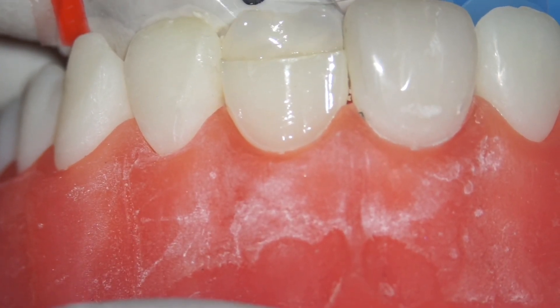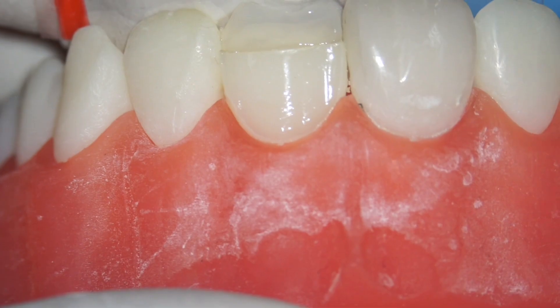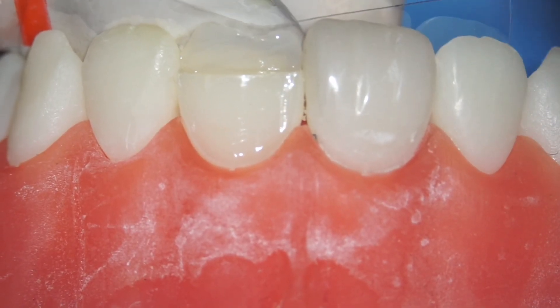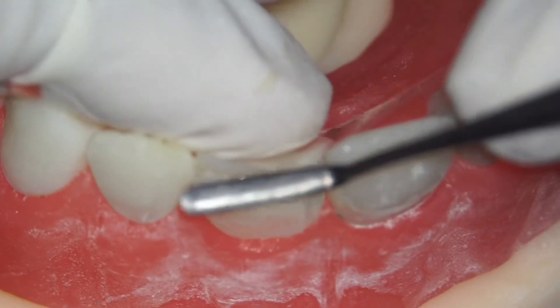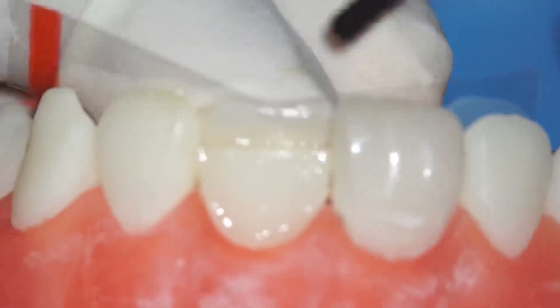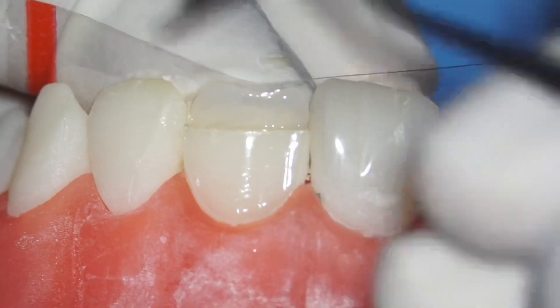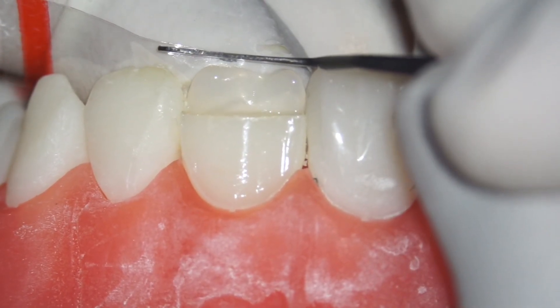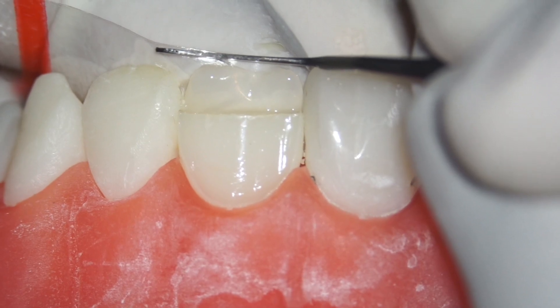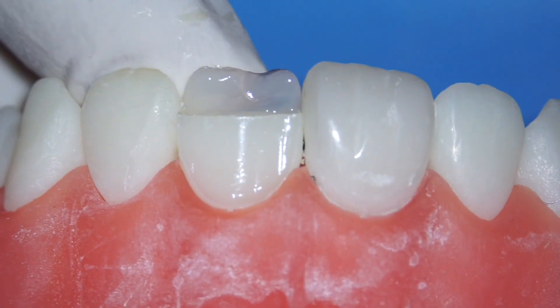Pull and check if you've got enough height. For this step you'll generally need your assistant to help you cure. While you're pulling and holding the celluloid strip, when you're ready ask your assistant to cure. Check mesially and lingually that there's enough composite, hold the plastic filling instrument at a comfortable angle, and cure. After curing, slowly peel the strip off — that's your lingual wall ready.